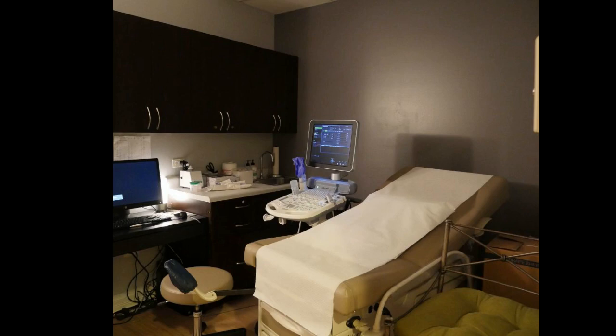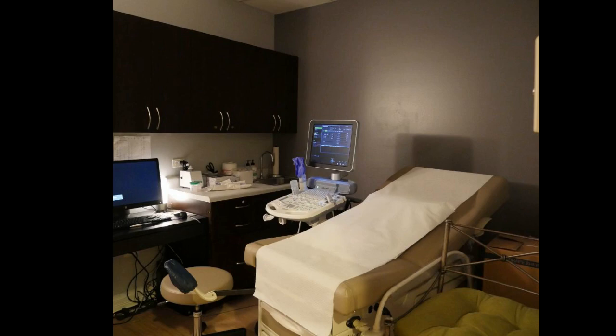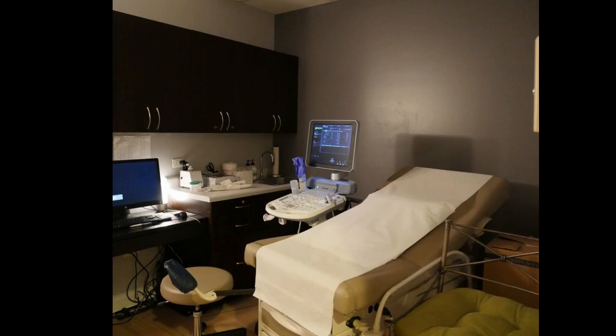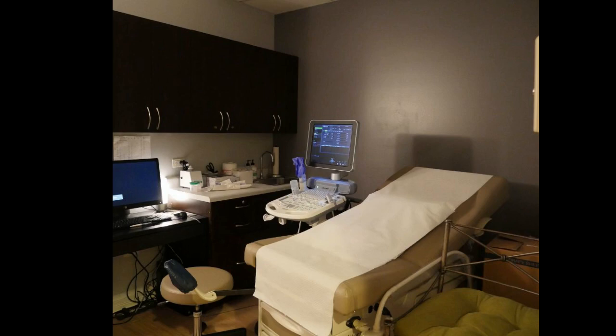Now that we've gone through all of the images of what a lower extremity venous study entails, I'm going to be showing a video of what it actually looks like. The video is going to be sped up a bit so we're not waiting through the whole protocol, because the protocol can take up to about 15 minutes per leg — that's 30 minutes total if it's bilateral. The time can go past 15 minutes per leg depending on the patient's body habitus or if the patient hasn't been drinking water. There are a lot of factors that determine whether the scan is going to be quick and easy or give you a bit more of a difficult time.